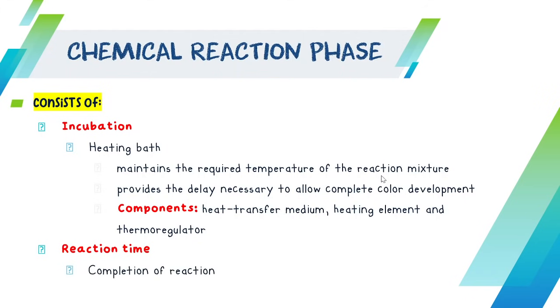Then, we have your reaction time. When we say reaction time, it is the completion of your reaction. So it is the rate at which the reaction is proceeding. And one of our ways of calculating the amount or the level of certain substances in our body is through the reaction time. So we need to get the reaction time.